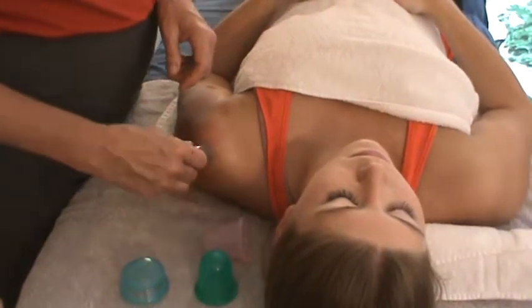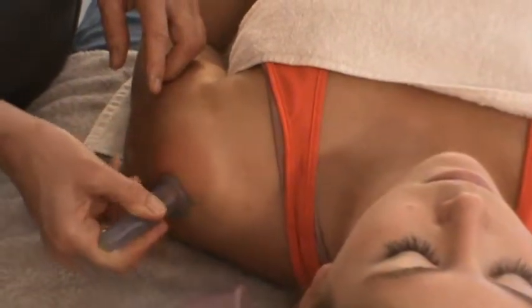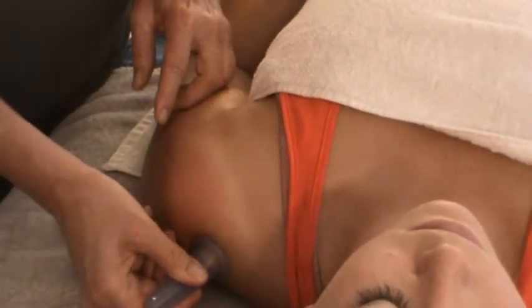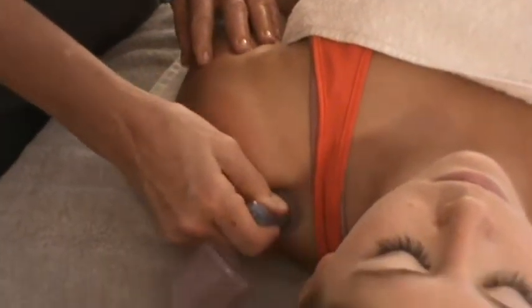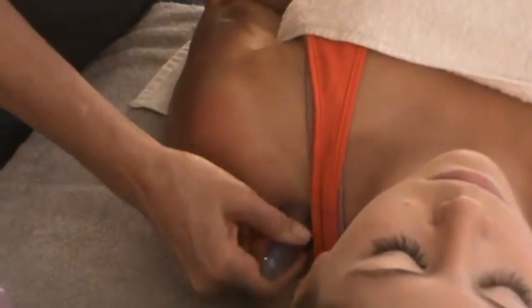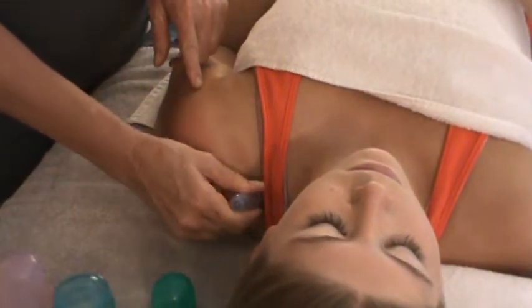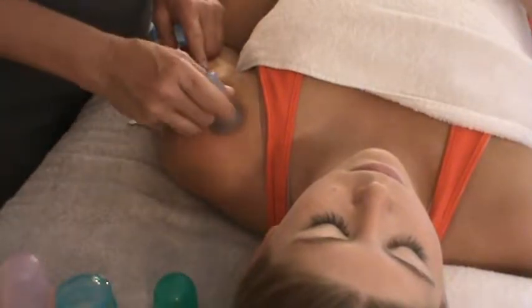So if, say, she had some shoulder stiffness and you had some difficulty with skin gliding around the shoulder, I could mobilize the soft tissue around the shoulder, starting with a very gentle massage to increase the circulation using the gliding cups. Patient's in neutral. She has her head on a little bit of a neck roll. It's for a neutral cervical lordosis. And just start to open up, and you can see there's some nice circulation response around the shoulder as I go. And this is a very gentle suction cupping massage.